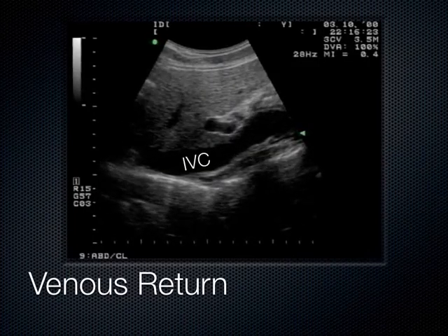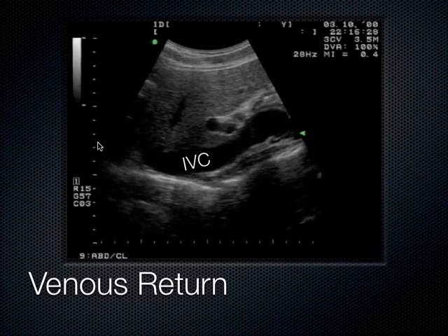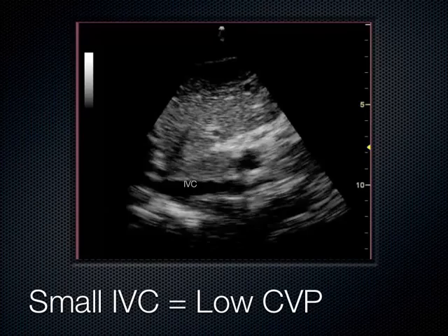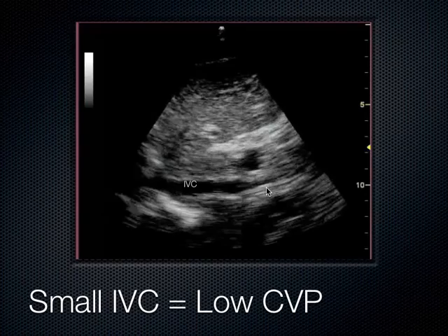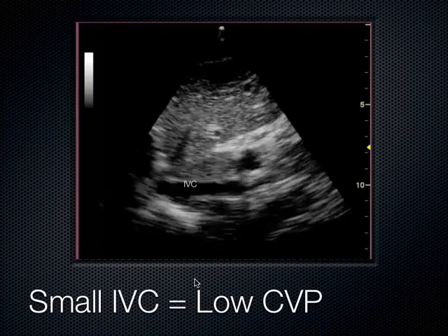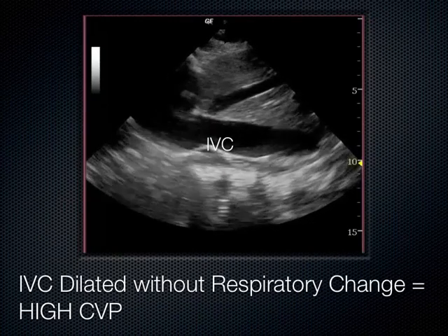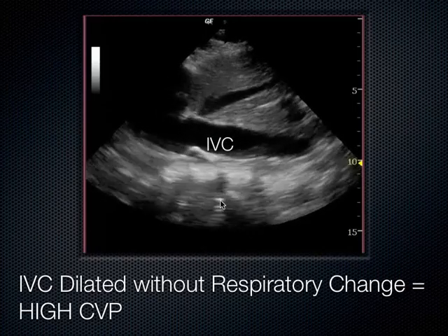This is what it looks like. This is a patient who's breathing in and out. There's absolutely no change of their IVC. If I had to look over here at these calipers, maybe it's about 1.5 or 2 centimeters. I'm not dropping calipers here, but I'm just kind of demonstrating that. Here's one that's a really small IVC that as they breathe in, it sort of collapses down. And we can see this collapsibility going on. As they breathe in, it just completely obliterates. So that's a really low CVP. This is somebody where I'm opening up the IV fluids. Another example here of a dilated IVC, no respiratory change, high central venous pressure.